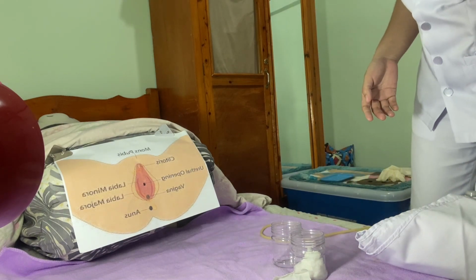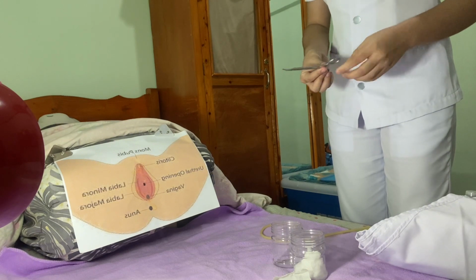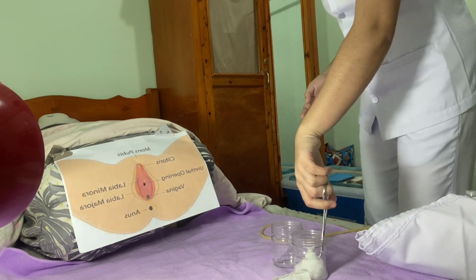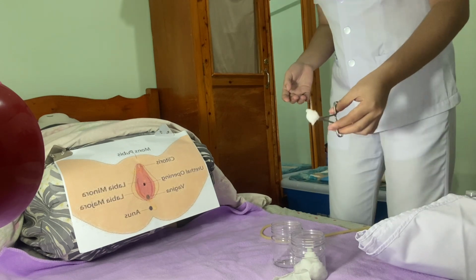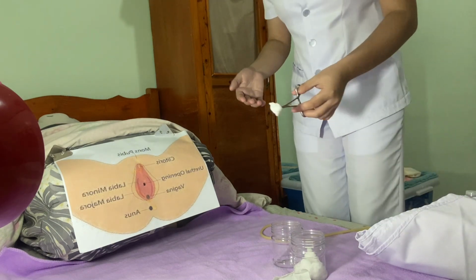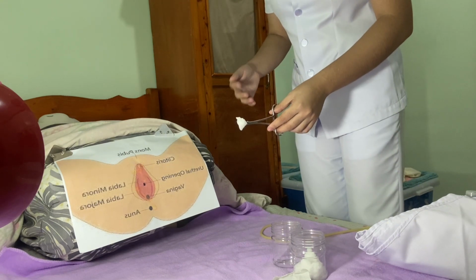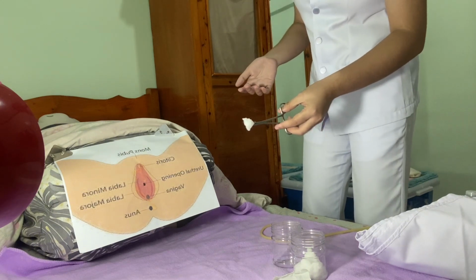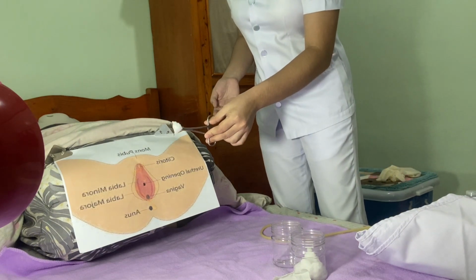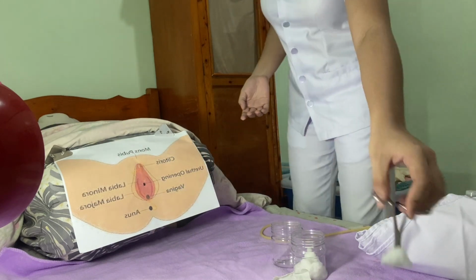So next, what I am going to do is to use my sterile forceps to pick up some cotton balls soaked in a cleansing solution or betadine to clean the genital area of the patient. So a thorough cleansing of the meatus and the area surrounding it reduces the possible introduction of microorganisms into the bladder. So first, I am going to line down and discard.